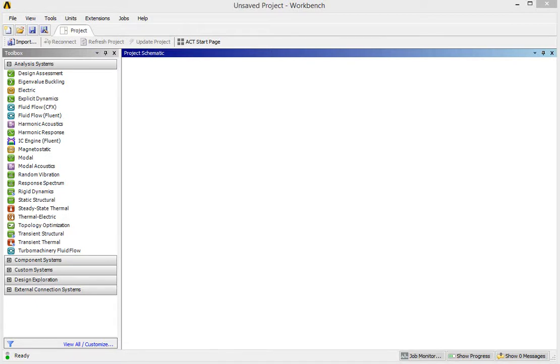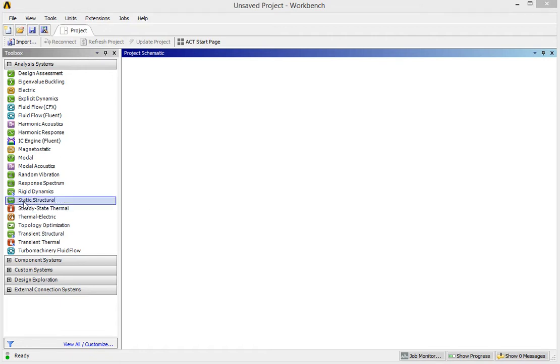In this video, we are going to explain how to use one of the ANSYS modules called Static Structure to do the simulations for hip implants.